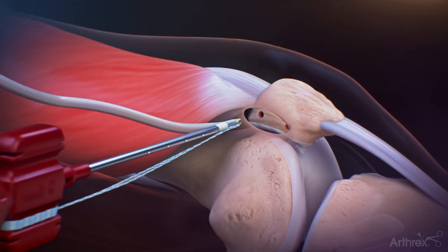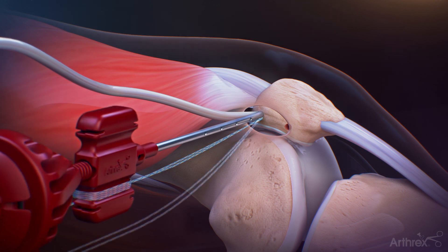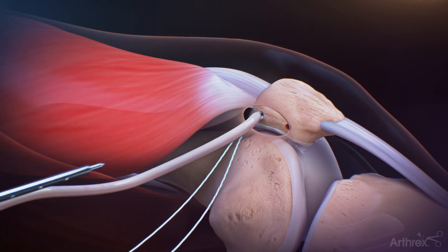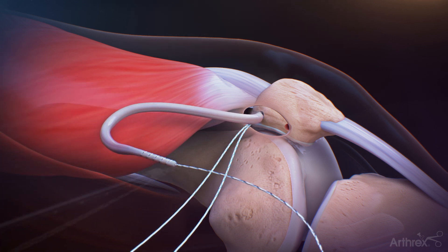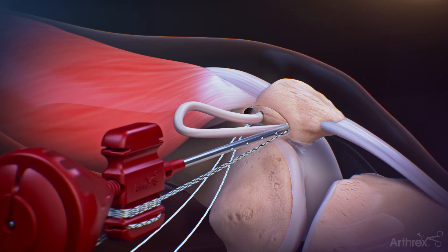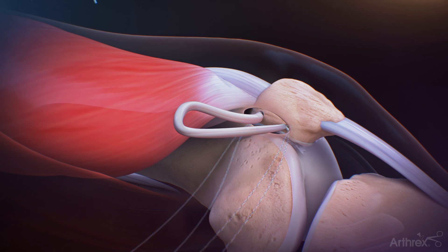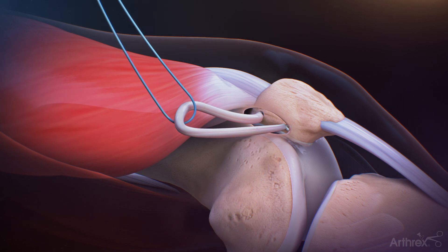Pass the suture tails of one graft end through the eyelet of the first 3.9 mm swivel lock anchor and push both the graft end and anchor into the proximal drill hole until the eyelet is fully seated. Maintain tension on the suture limbs and screw the swivel lock anchor into the patella. Repeat the swivel lock insertion procedure with the second graft end. Place a blue number 2 fiber wire suture onto the graft.